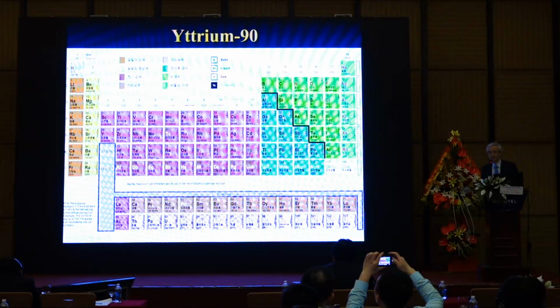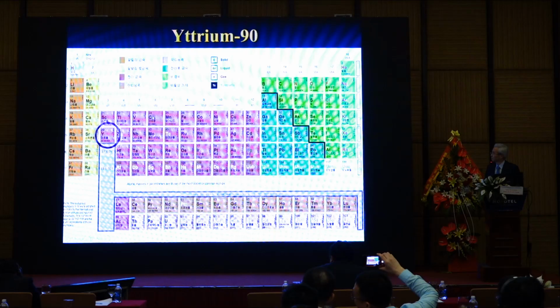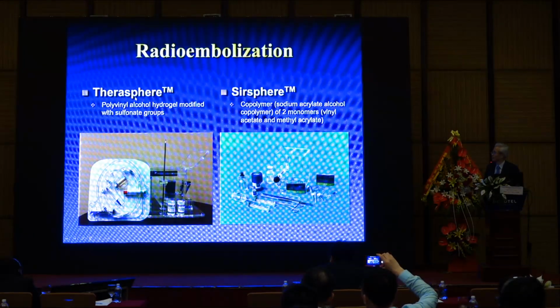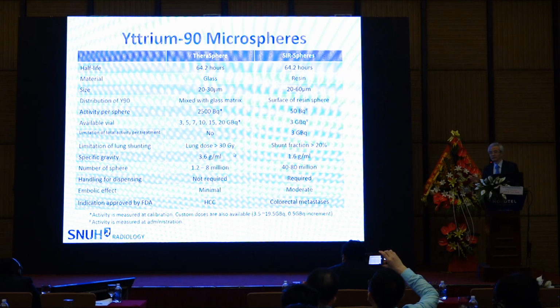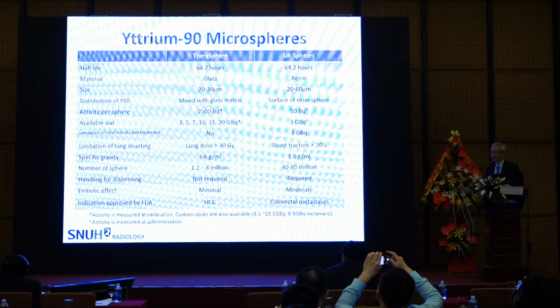How about the radioembolization? This is yttrium. There are two products available in the world, TheraSphere and SIR-Sphere. This slide summarizes the difference between the two. The major difference is the number of particles, much smaller in TheraSphere.